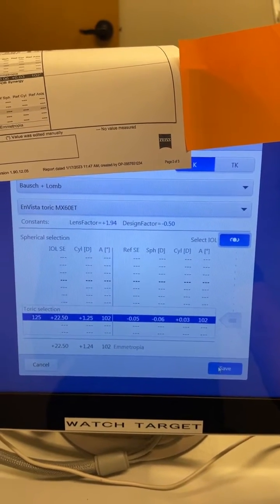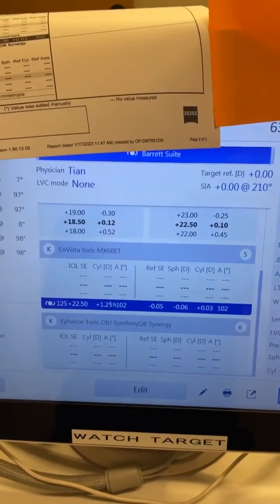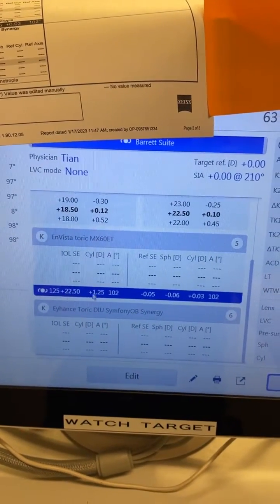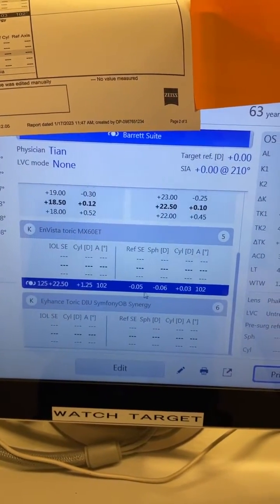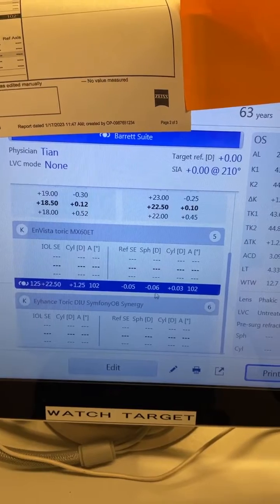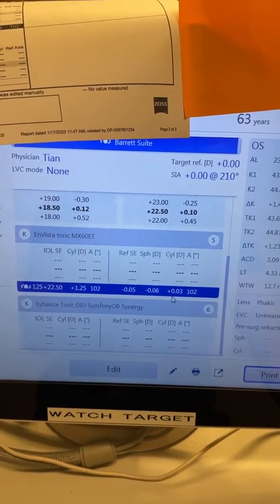Then you can save, and when you print this out, you can see there is a very appropriate lens for this patient that will give them basically no residual refraction.